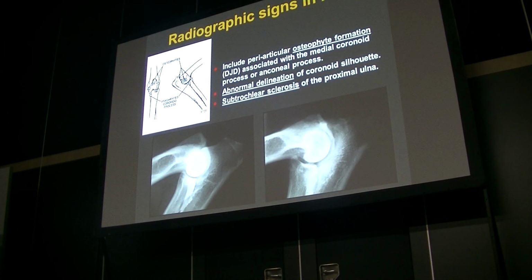So, in general, we take these radiographs to start with the flexed mediolateral one, and on the left we have a normal X-ray, where the bone is nicely delineated. All the three bones are very sharply presented on this image. Also, if we look to the delineation of the coronoid process, it's having a nice homogeneous density, nicely delineated, triangular, concave shape. And this area is the area where we can visualize sclerosis.